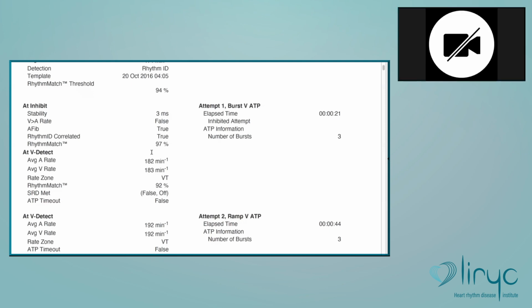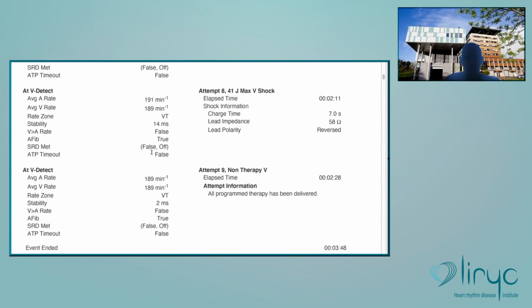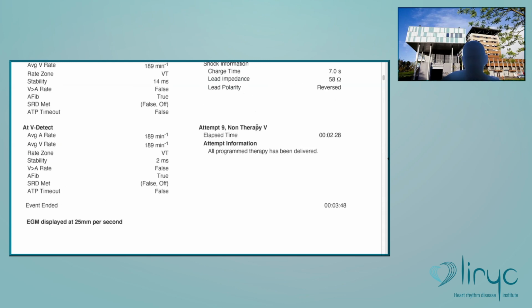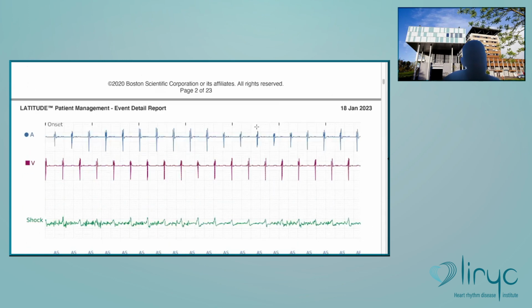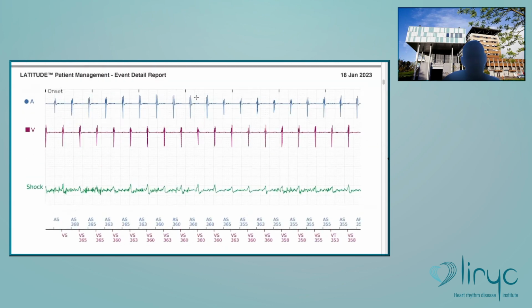If you have a look, you see the patient. I have reviewed more or less all the treated episodes in patients with Boston devices, in all the patients from Bordeaux, Clermont, and Toulouse. You see, so many patients, and this situation with many episodes of inappropriate therapy in a row is not infrequent. In Boston, if you receive one, you have a high chance to receive many.